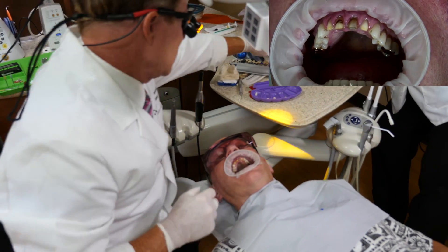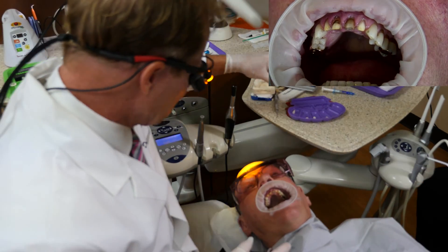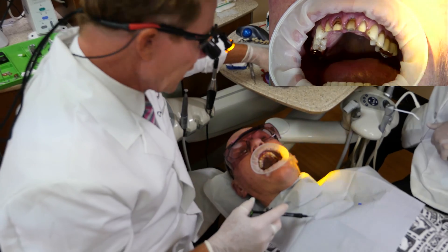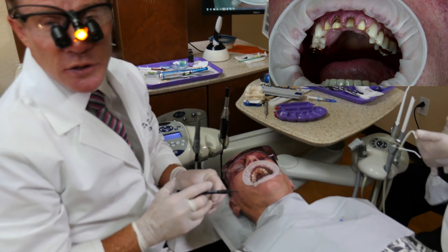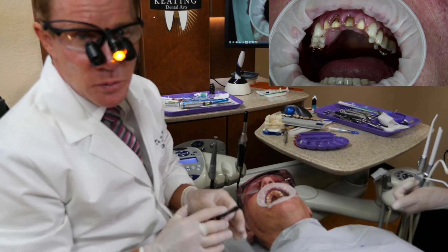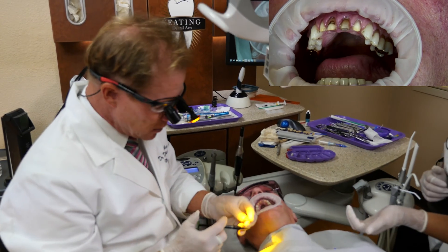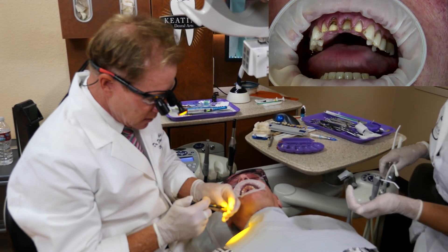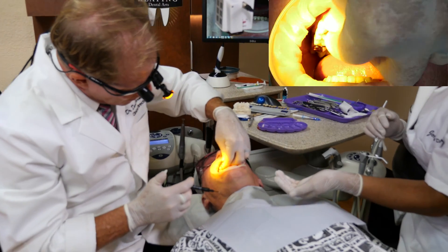We're going to go ahead and be using a light cure only resin cement. This is Verilink aesthetic. In a PFM — porcelain fused to metal crown — or the traditional monolithic zirconia, we would use a dual cure. But because this aesthetic material is so translucent, we can use a light cure only. So we go ahead and load the crown and put it into place.